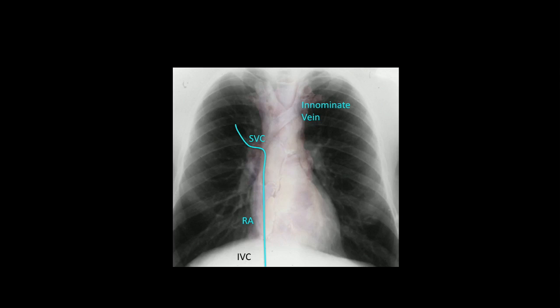What might this be? Yeah, it's pulmonary vein. So azygos, I'll show you in a minute. That's not a bad guess, but it's too far into the lung. But if there's a partial anomalous pulmonary vein coming in, or a pulmonary vein coming in, that's where your catheter would end up. What's this? That's the azygos, right? But it depends on what it looks like on the lateral view, okay?